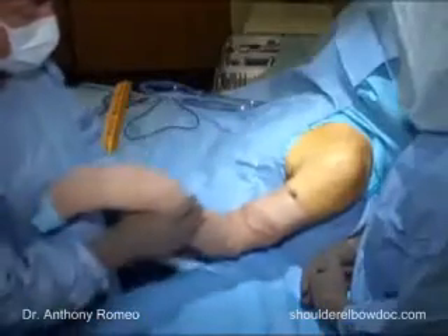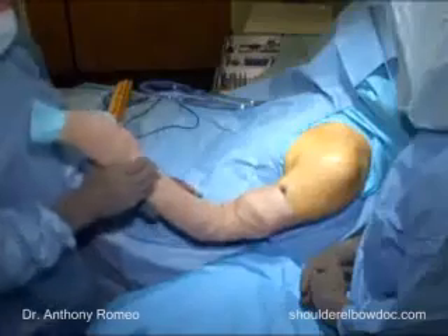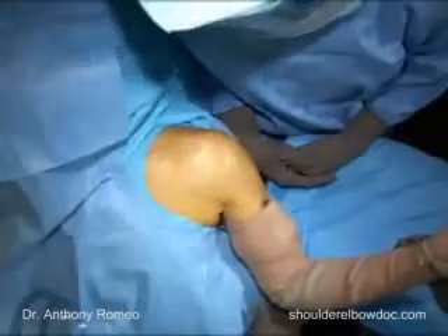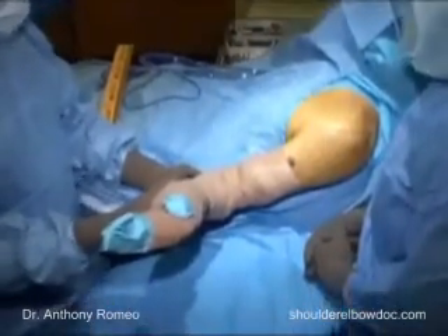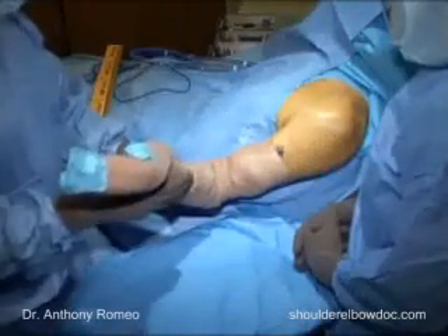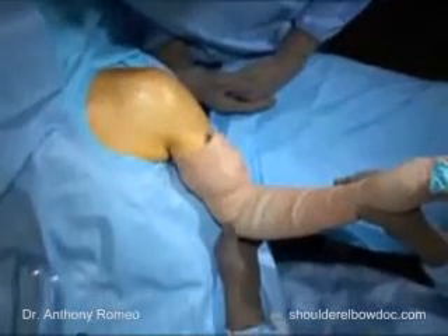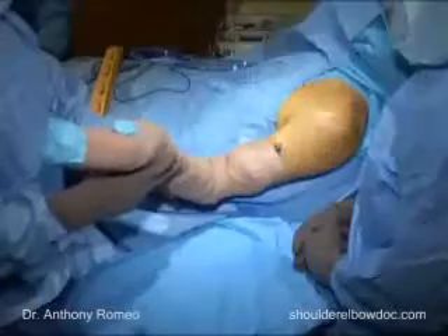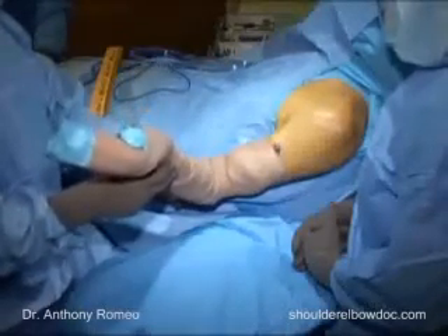We check range of motion under anesthesia to confirm that this is what we see preoperatively. We put the patient's arm comfortably at their side. His external rotation is at least 60 degrees. This is a useful parameter because when patients have a problem with external rotation, we may need to modify our approach to the shoulder joint to try to improve their rotation. Generally speaking, we can gain around 40 to 50 degrees of external rotation during a procedure.